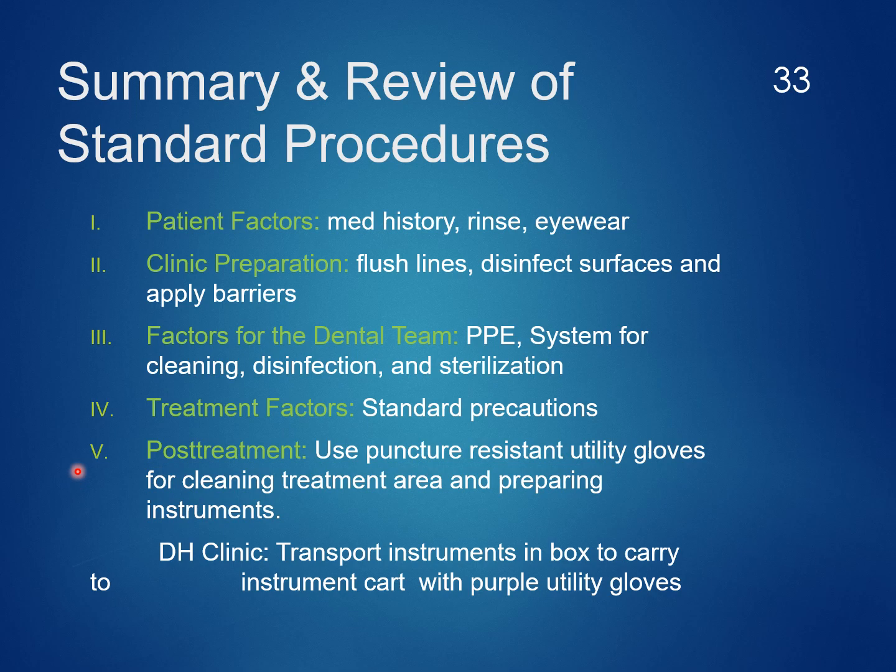And then post-treatment, we're going to use our puncture-resistant purple utility gloves for cleaning our treatment area and preparing the instruments for sterilization. I would like to mention, I know we had mentioned to get the small plastic shoebox. In the DH clinic, you're always going to transport your instruments in this shoebox and carry them to the instrument cart with your purple utility gloves.